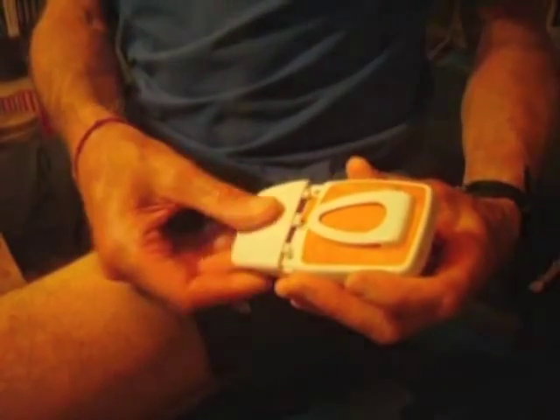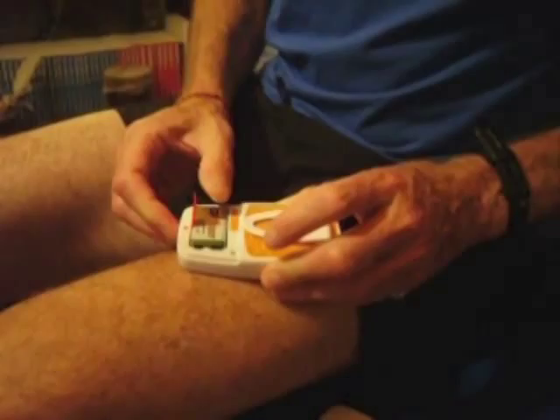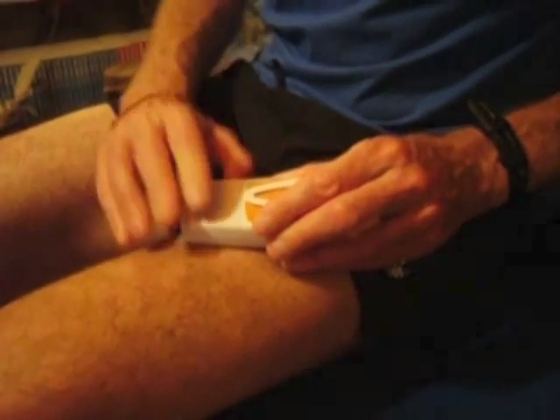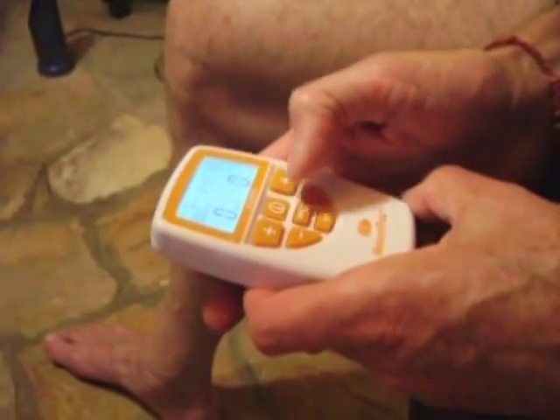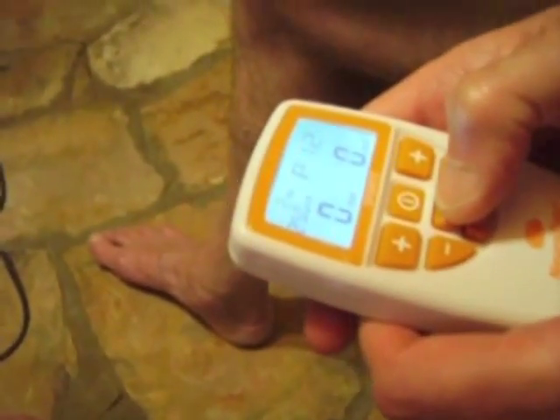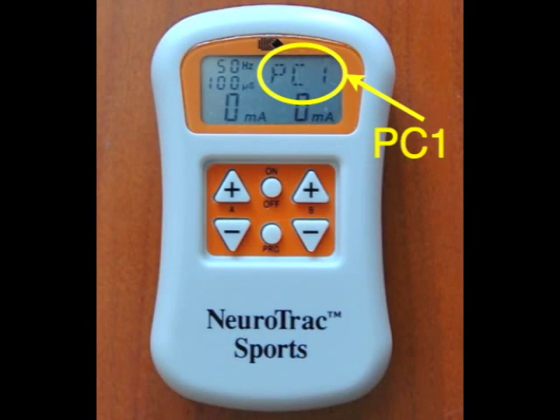The muscle stimulator comes supplied with a battery but the battery is not fitted, so the first step is to open the back of the machine in order to put the battery inside. Then you can turn the machine on by pressing the on button and scroll through the programs by pressing the program button until you arrive at PC1, which is the first of the customizable programs.